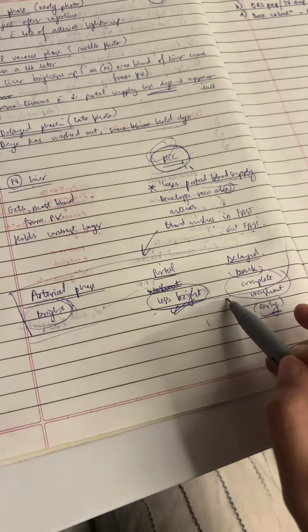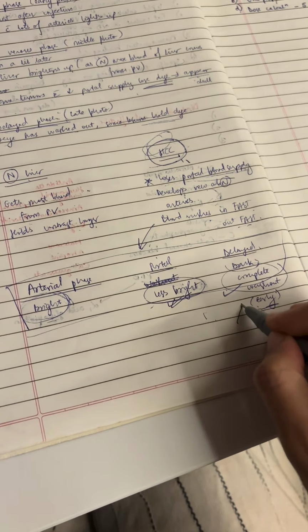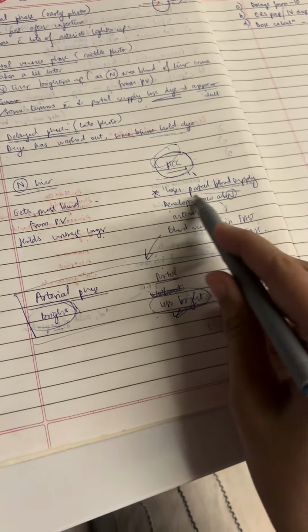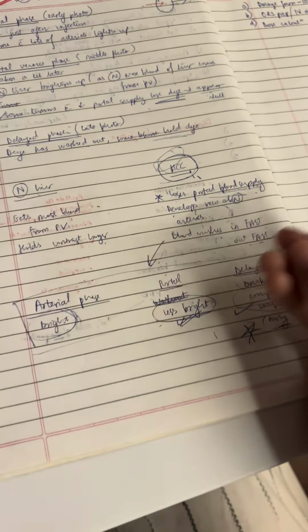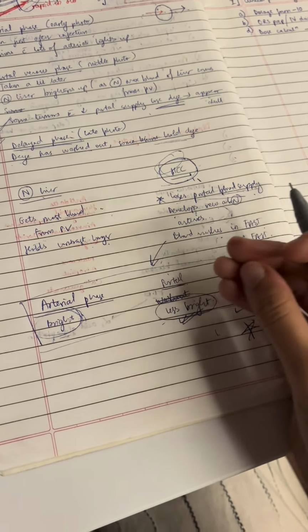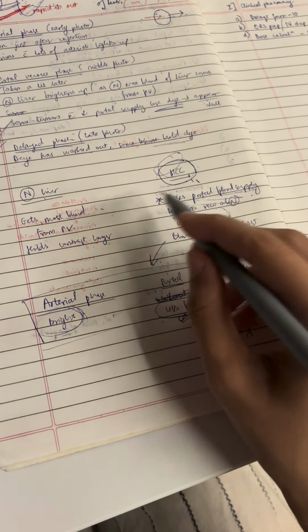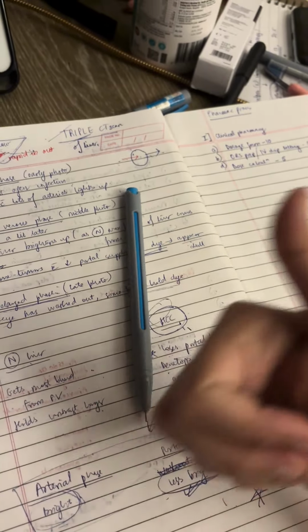This is known as the complete washout. It's also known as the early washout of HCC, a very characteristic finding. This is because there is less portal blood supply in the HCC, right? So while the normal liver has lost most of its dye, it will still appear a little bright. But HCC, no portal blood supply at all. So completely dark. So yes, that's it. I hope you understood this well.